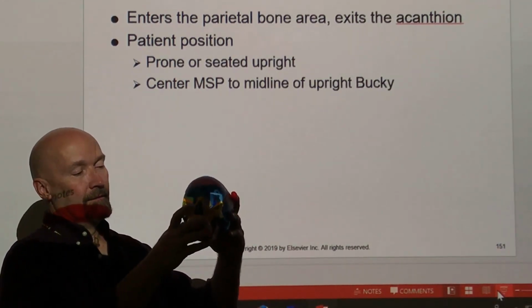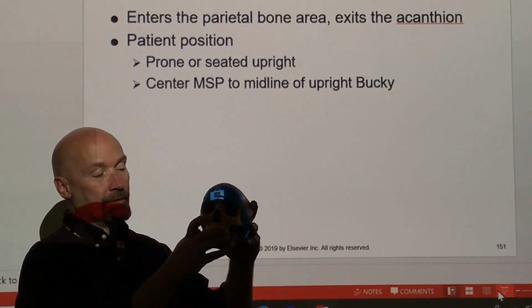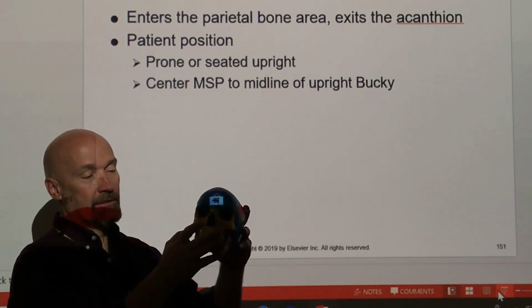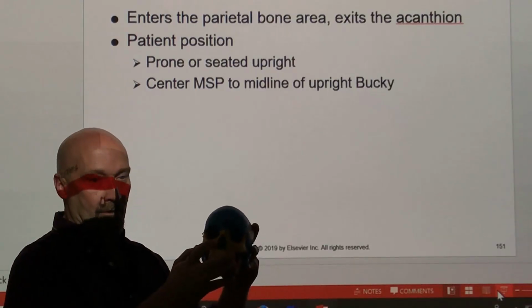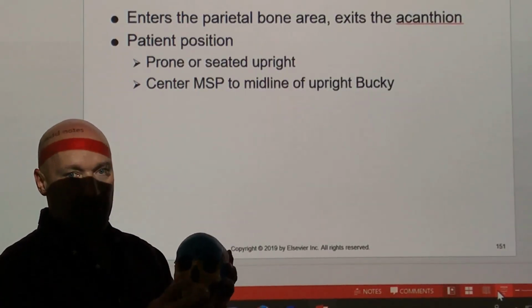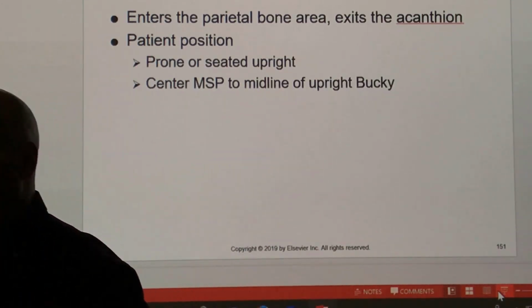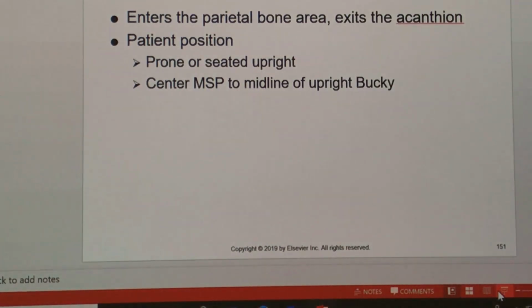The 55 Waters is going to put the petrous ridges inside of the maxillary sinuses. You're not going to see evidence of blowout fracture, but you might be able to see the fracture itself. So sometimes your orbital series will call for both. I know we're talking about facial bones right now, but for orbits you may have to shoot both.